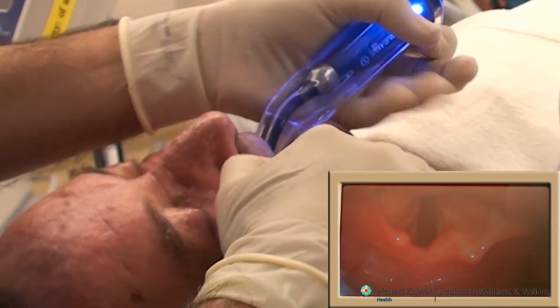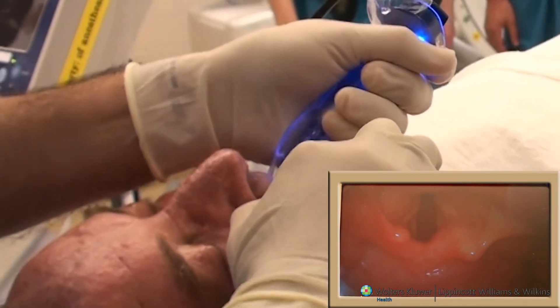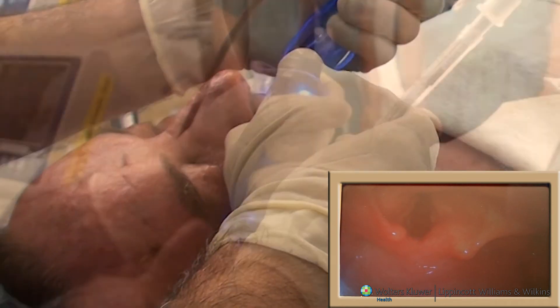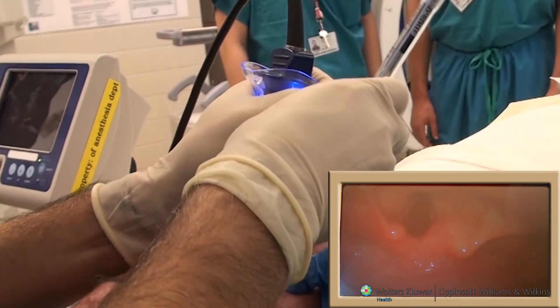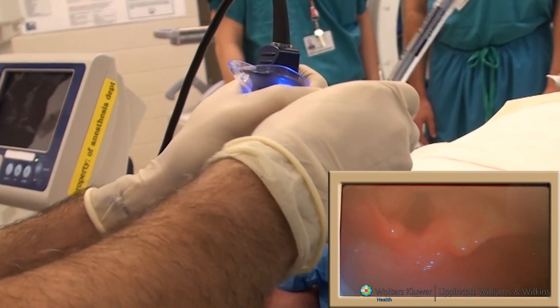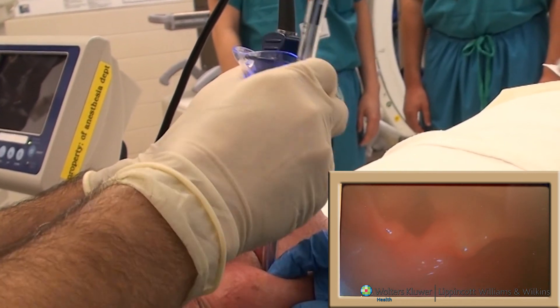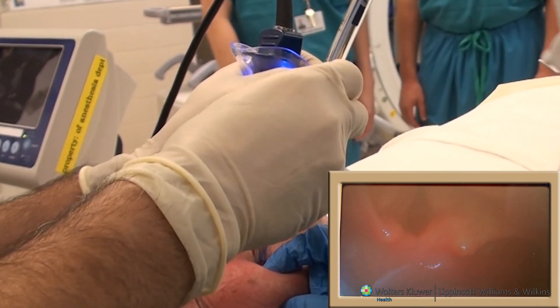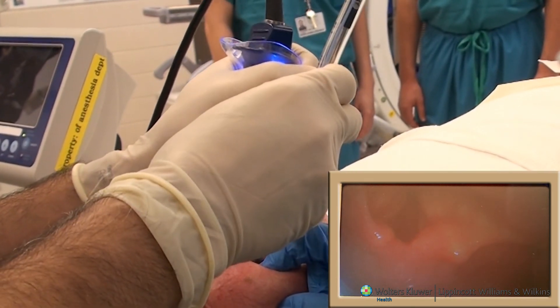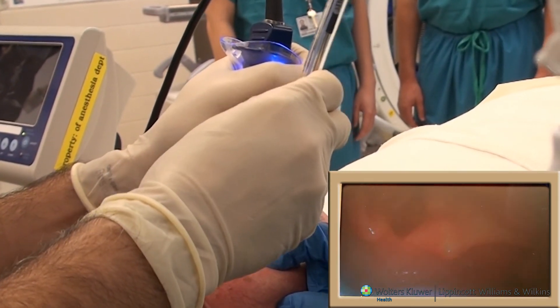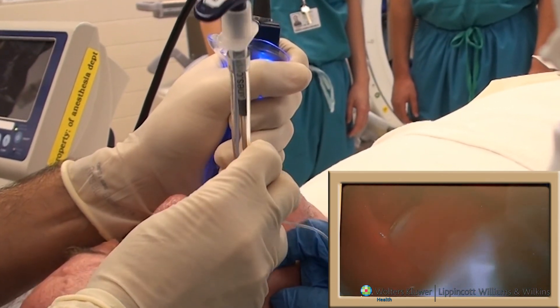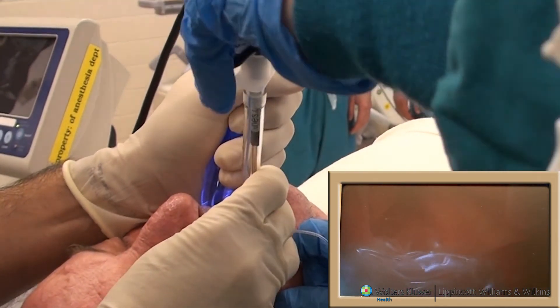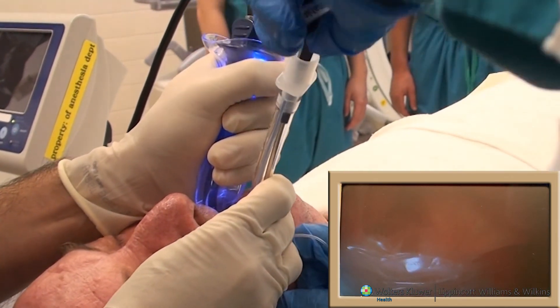However, the operator can visualize the larynx with minimal displacement of the tongue. As demonstrated here, the 60-degree angulation of the blade reduces cervical spine motion. Theoretically, the airway axes do not need to be aligned to achieve a good view.